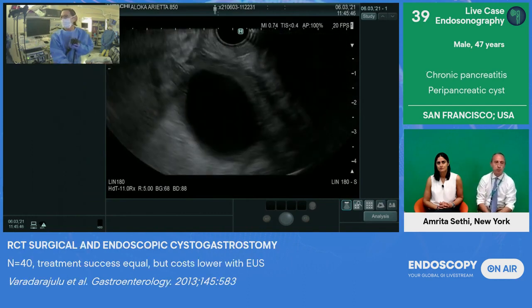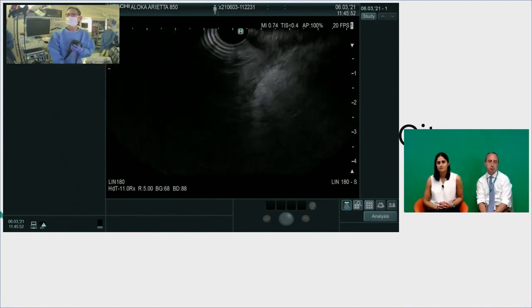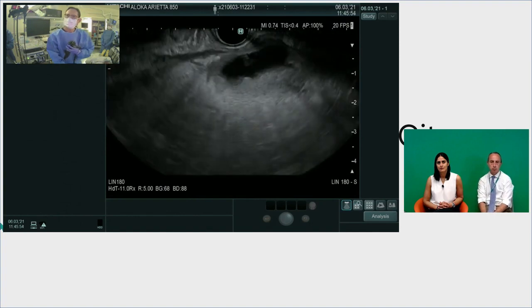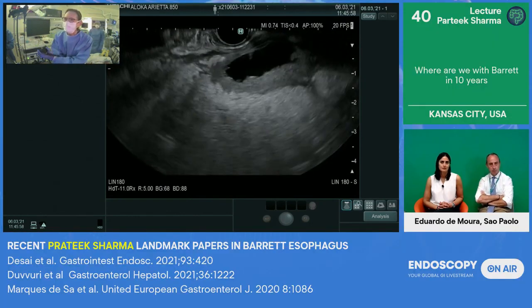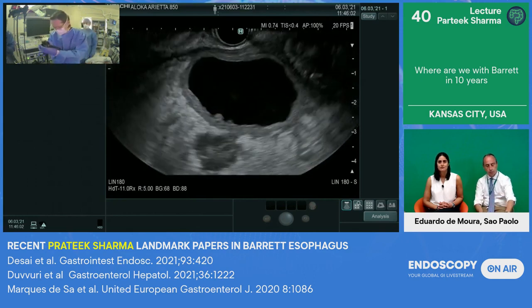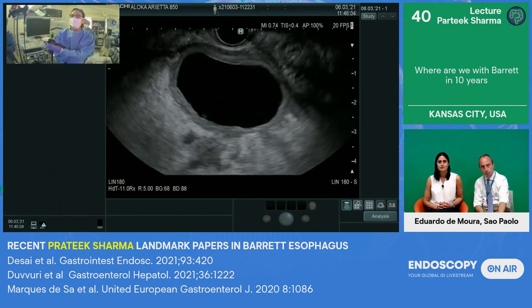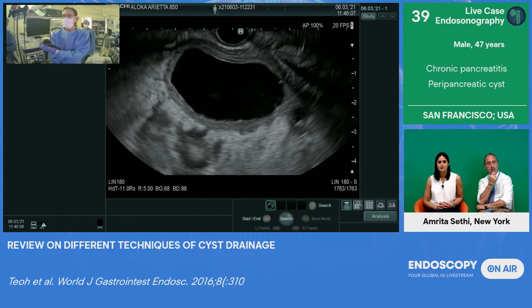And here it's starting to come into view. So here's something. Here it is. All right. So you can see there's a lot of inflammation around it. And I estimate that it measures 4 centimeters. So let's measure it. So we have 4 centimeters on the CT scan.